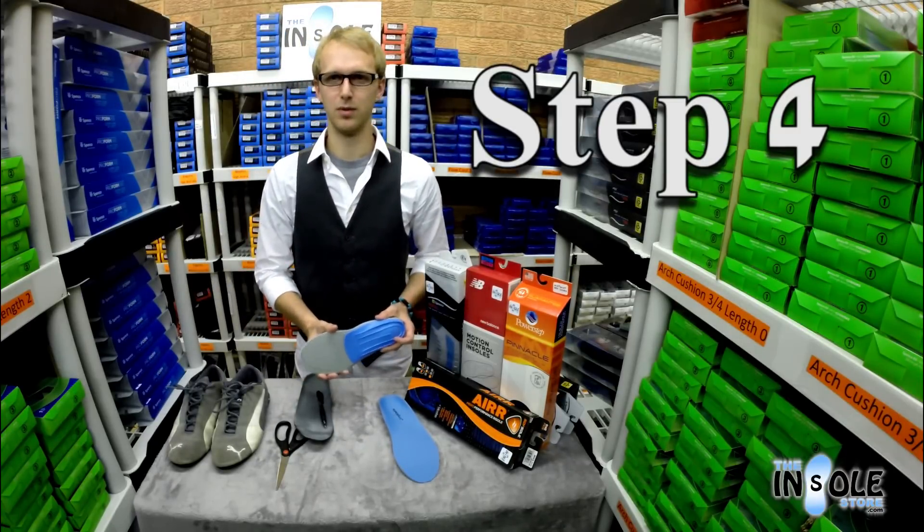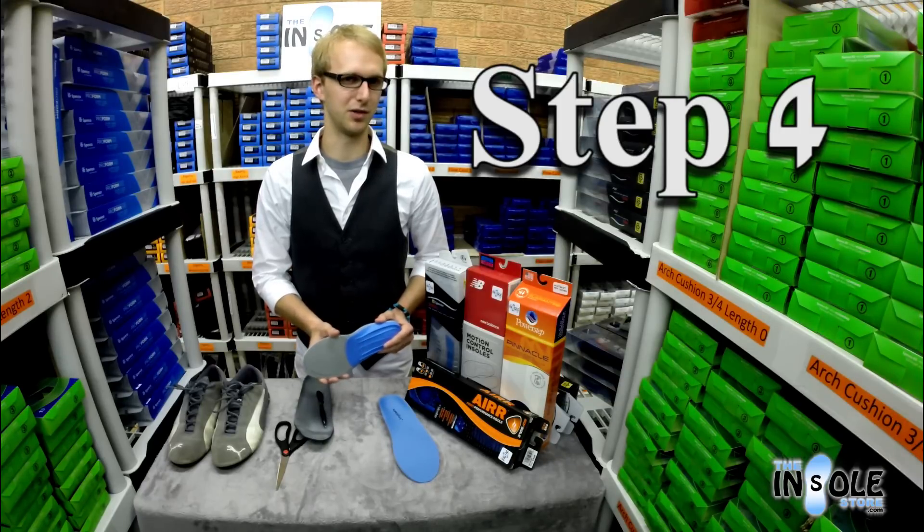By cutting along this line we're going to trim the insole to fit perfectly into your piece of footwear.